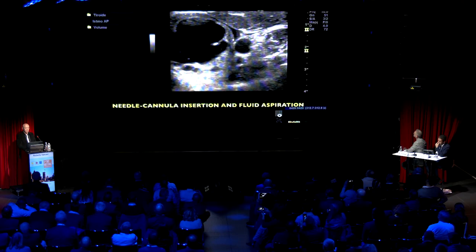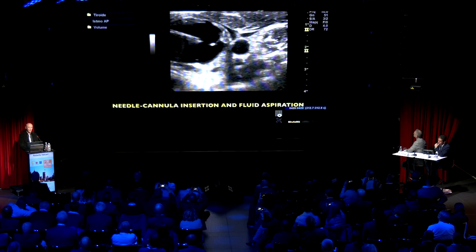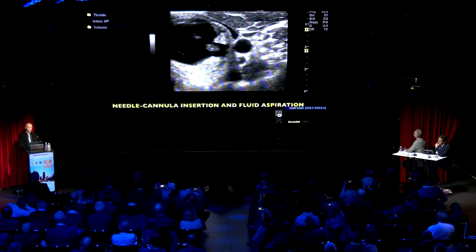And this part of the video shows the insertion, as seen by ultrasound, of the needle cannula, and after placement of the cannula in the center of the cyst, the stylet is withdrawn.